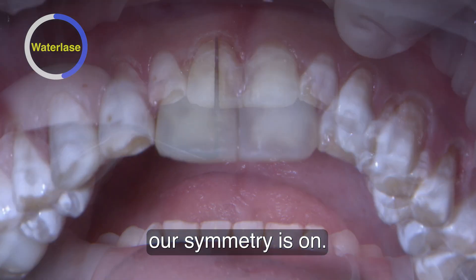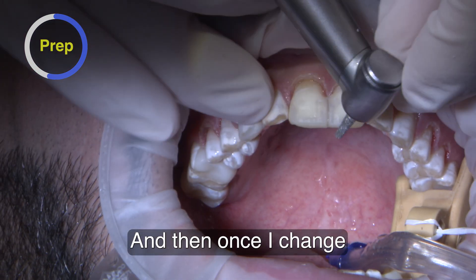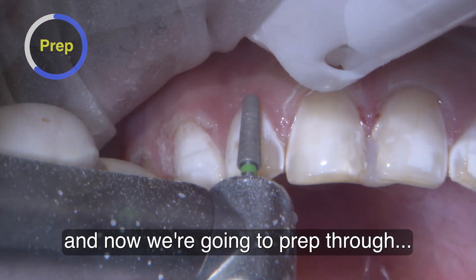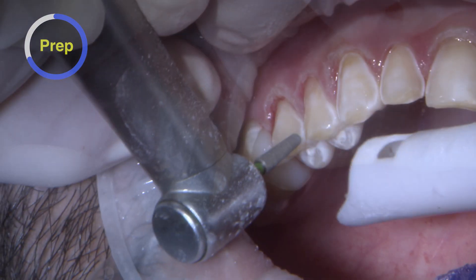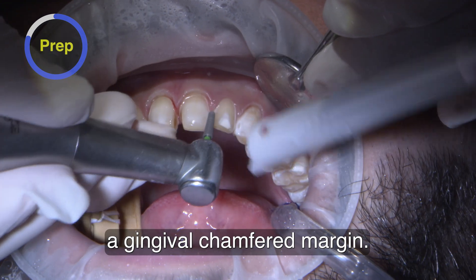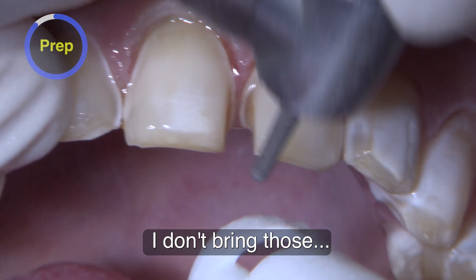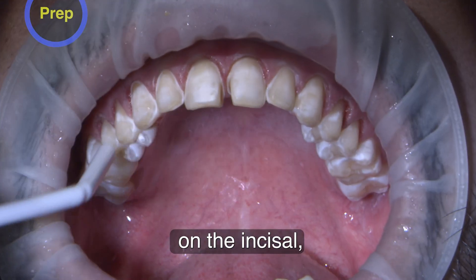Make sure our symmetry is on. And then once I change the gingival architecture, we prep through — large round end tapered diamond. I'm really just trying to establish a gingival chamfered margin. Since his centrals were a little lingually inclined, I don't prep too much away. And since it's mostly additive on the incisal, I don't take much away off the incisal either.